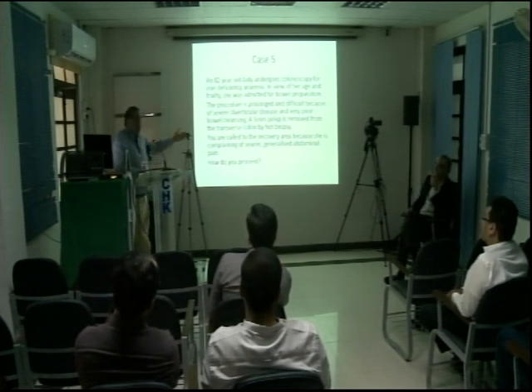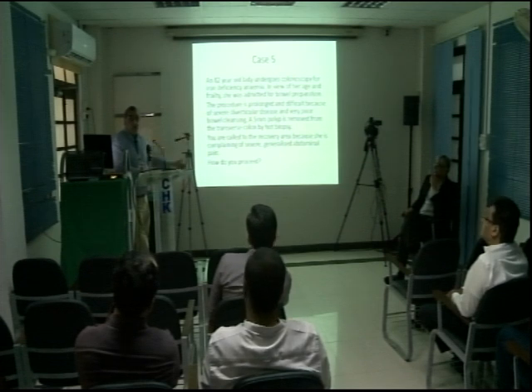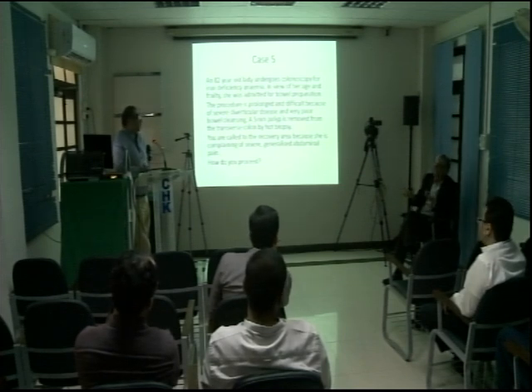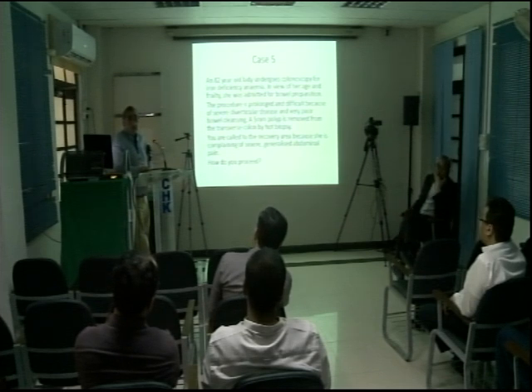Secondly, would you remove the 5 millimeter polyp? I probably wouldn't. And if you remove a 5 mm polyp with such bad bowel prep, how will you recover it? If you don't recover the polyp, then what is the benefit of taking it out? Look at her age, she is 82 years old.